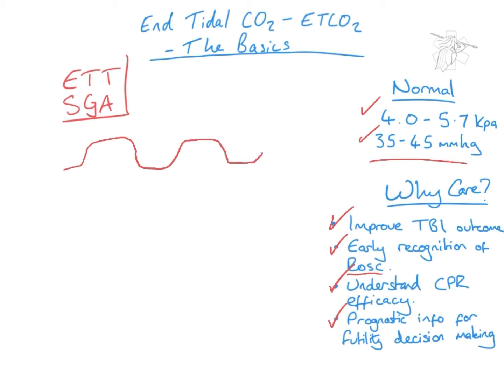And this is just telling us a bit of a story about the way that the patient's breathing, or the way that we're ventilating the patients, and the efficacy of that really. So we're looking for a nice equal distance, just like an ECG really. So we're looking for symmetry. We're looking for that good distance between each of these little top hat pictures.